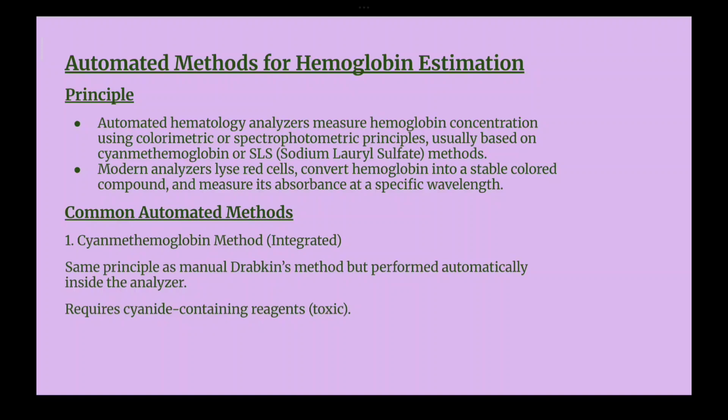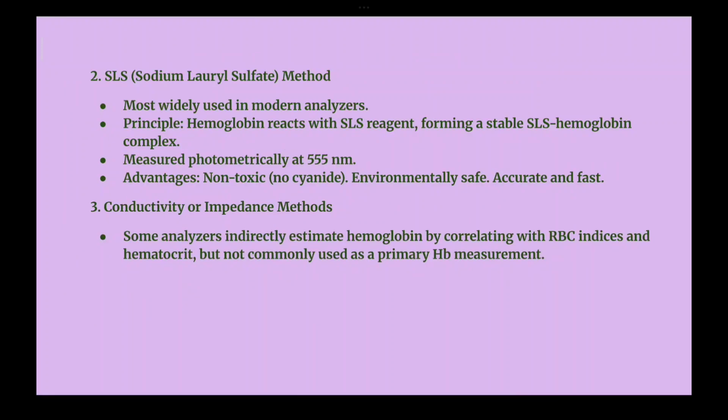So it works on the same principle as Drabkin's method, but it is performed automatically by the analyzer. So the same method is adopted by the automated cyanmethemoglobin method. Here it requires cyanide-containing reagents, which is again a toxic solution that you are adding.